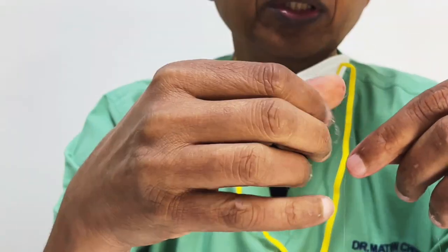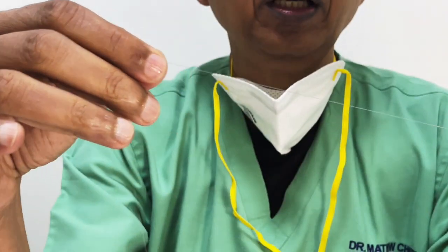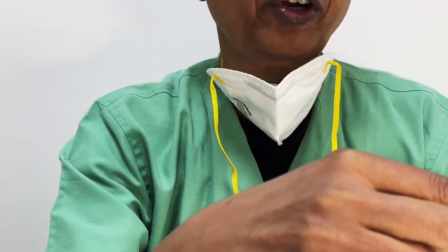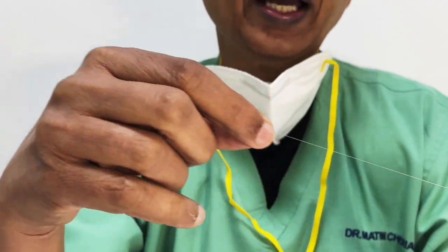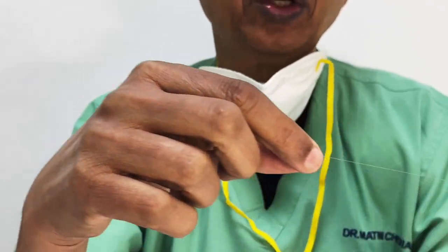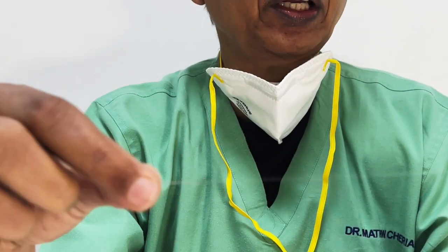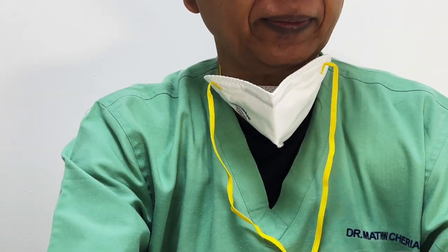Now, what are the things about this coil? We'll show you a better coil to show the shape it takes. But remember, there is nothing in the form of a fiber anywhere. See that? There's no fiber. Because of that, they are thrombogenic but much lower. Have you got it? That's why we need a lot more coils, even in a small aneurysm, than what you would require with a fibered coil, right?